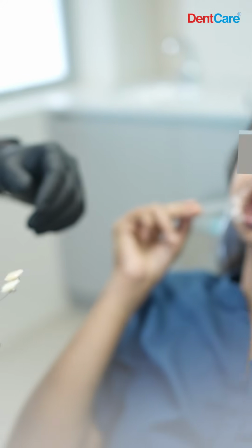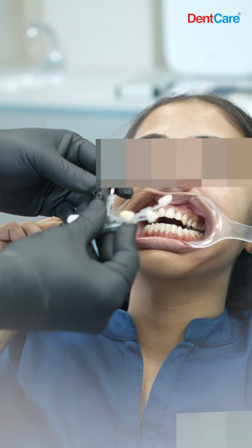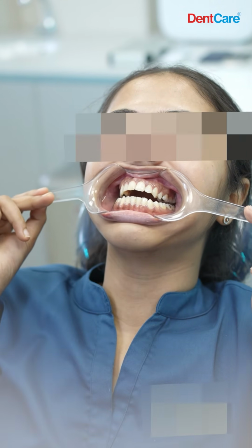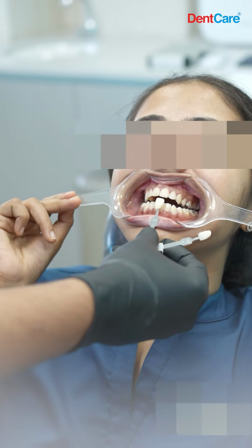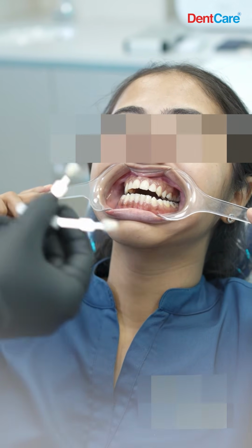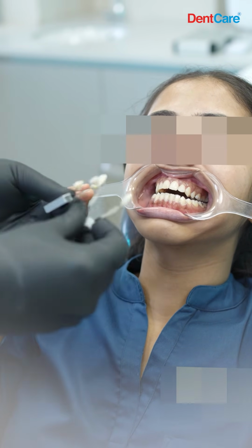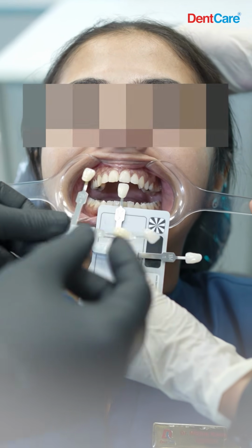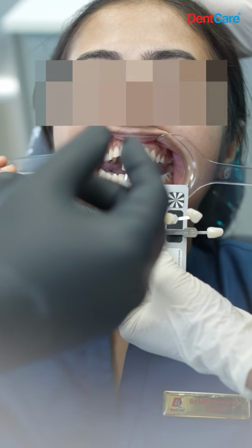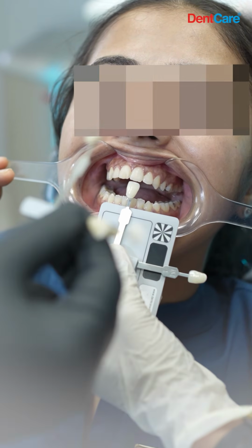Let's do it. The most important thing is we need to open the mouth. The shade tabs need to be in the same plane as that of the tooth. We can't keep it in front or behind. We need to keep it as close to the tooth as possible and in the same plane as the tooth. And next, if you're taking a photograph, we need to place a gray card too. You can keep both these shade tabs to get an idea as to which one matches better, or you can do it separately.